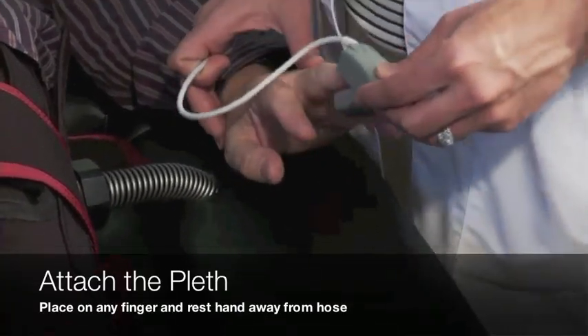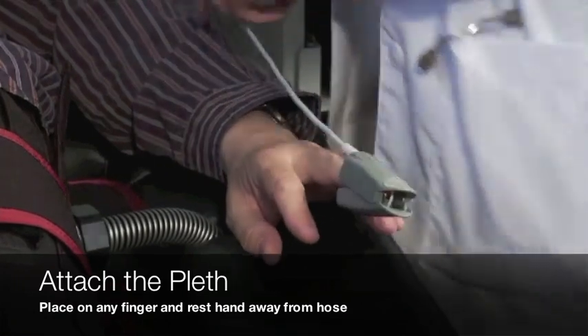Place the pleth on any finger and rest the patient's hand away from the body and the hoses.